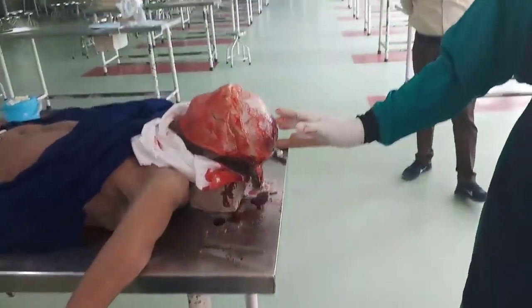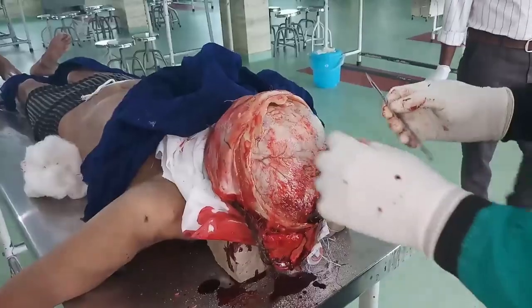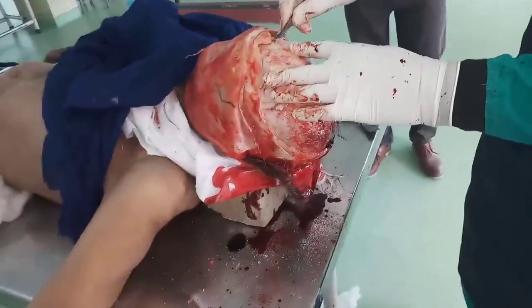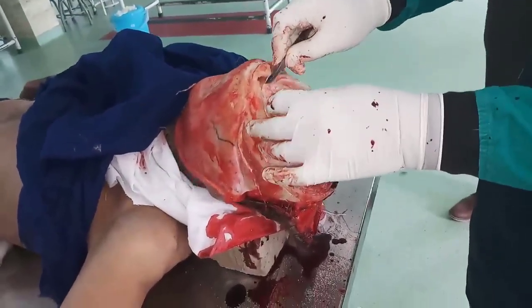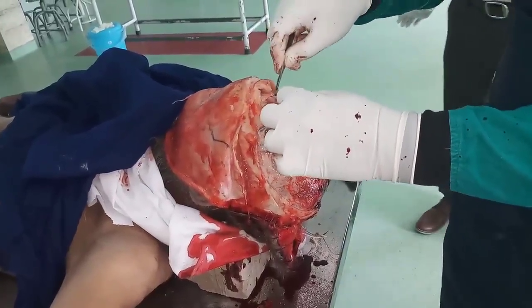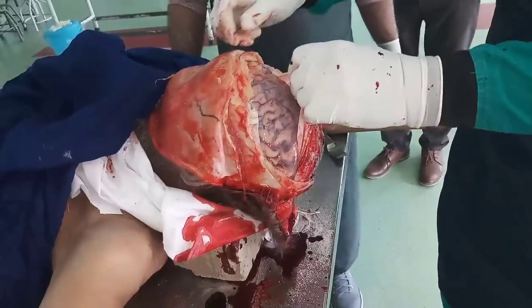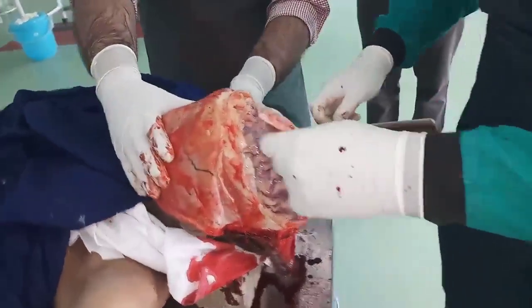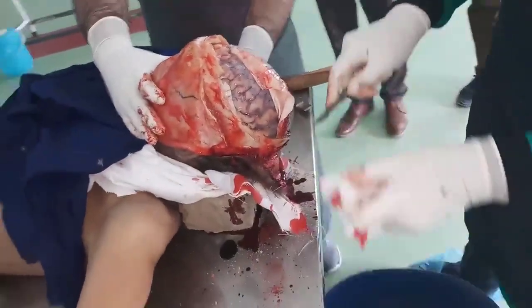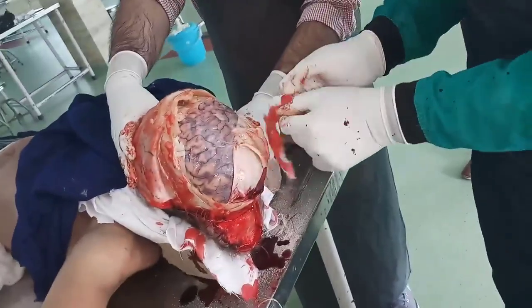So we have removed the skull cap. Now you can see the dura mater. We will remove the dura along the same line of incision that we removed the skull cap. This is a free flap of dura, the fold of dura.